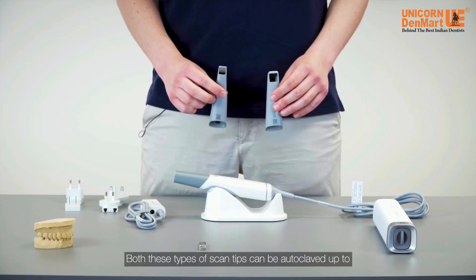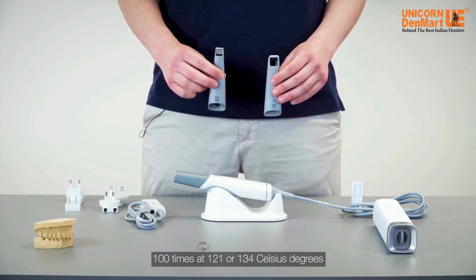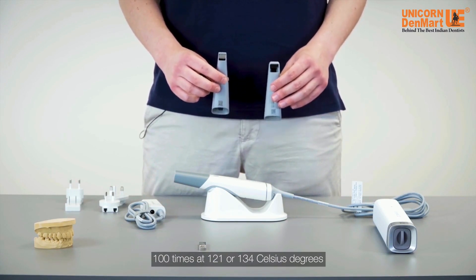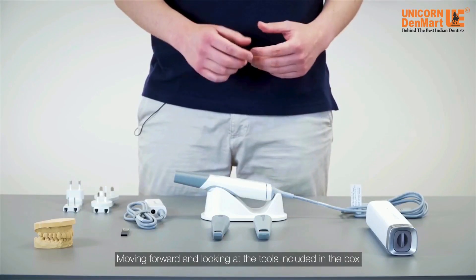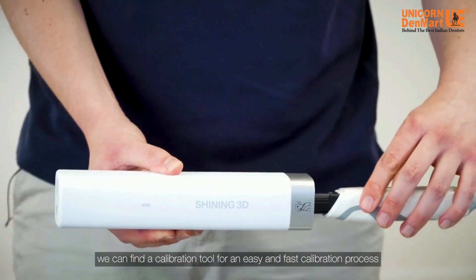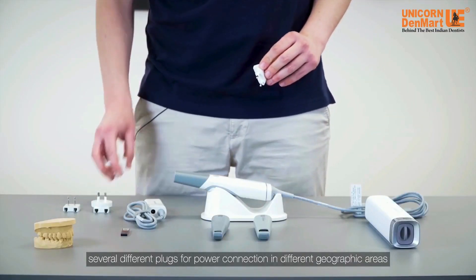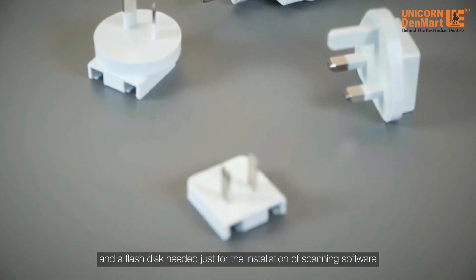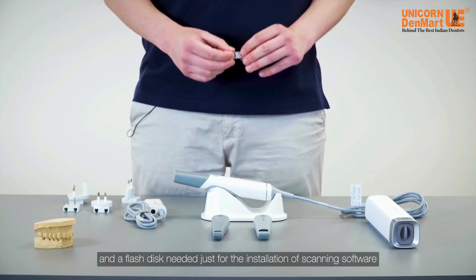Both these types of scan tips can be autoclaved up to 100 times at 121 or 134 Celsius degrees. Moving forward and looking at the tools included in the box, we can find a calibration tool for an easy and fast calibration process, and several different plugs for power connection in different geographic areas.